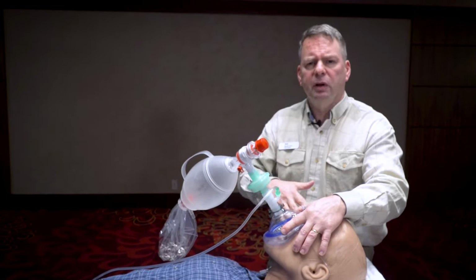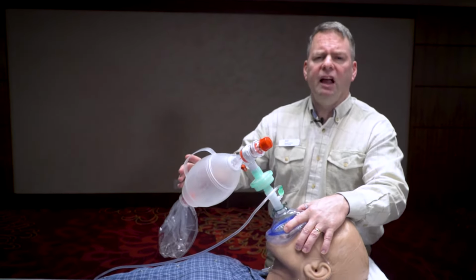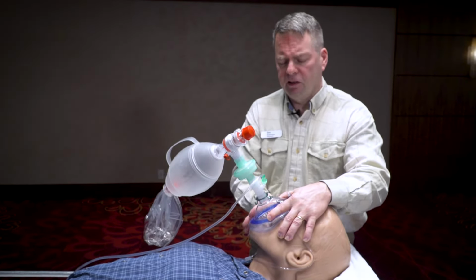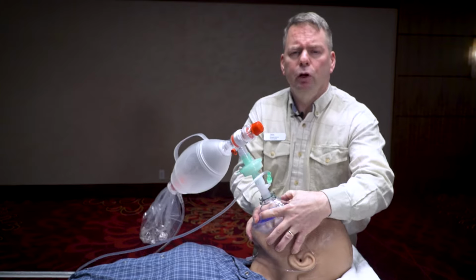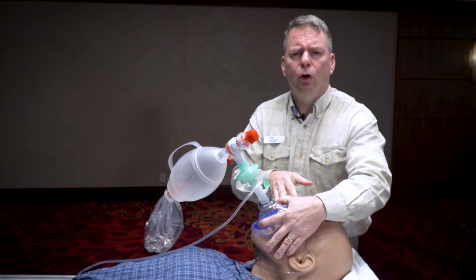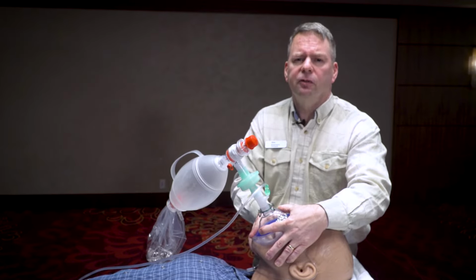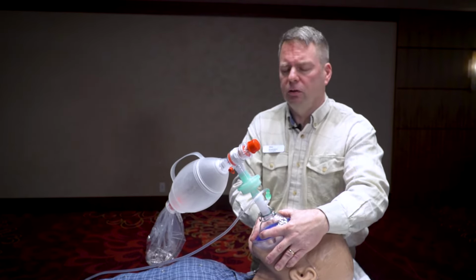Typically, you would lay somebody flat and bag them with the bagger using high pressure, and that will often go into the stomach. In this way, I'm able to give them low pressure with high flow and keep them sitting up, which works better for their lung mechanics as far as oxygenation and absorption of oxygen in the system.